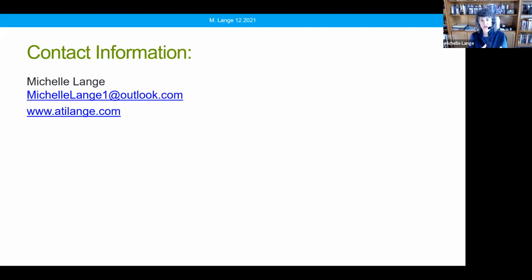So Andra has said, I am working with a family that will be paying out of pocket for a mount. However, they ordered the iPad and a child's foamy case first before they considered the mount. Which company would be easiest and most affordable to work with to fit a mount to this iPad case, or will they have to get a new case? So you have a couple options. Lots of people use those large, very padded cases so that if a child or adult drops it, it's less likely to be hurt.